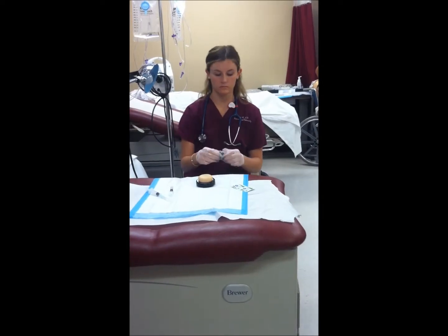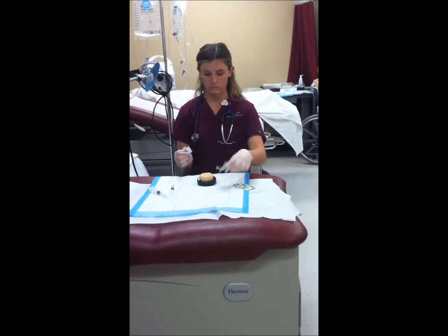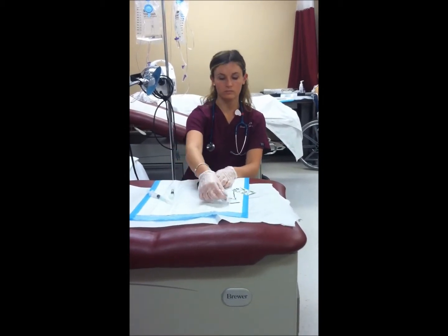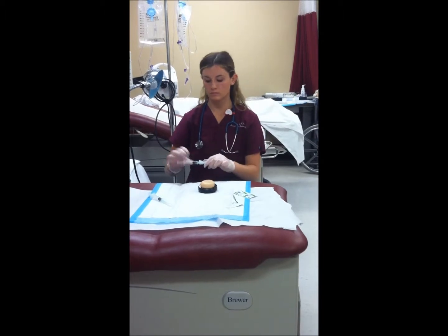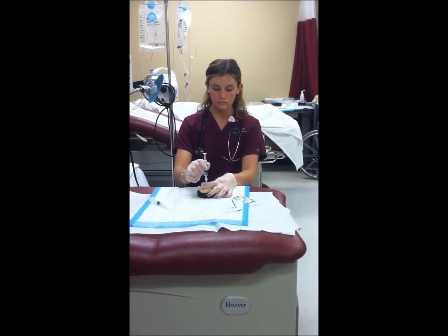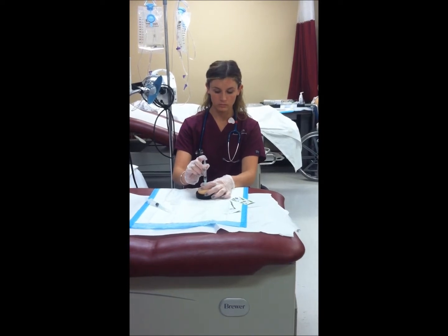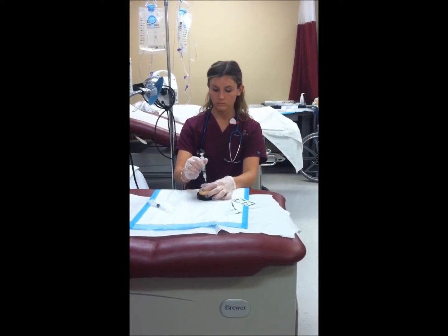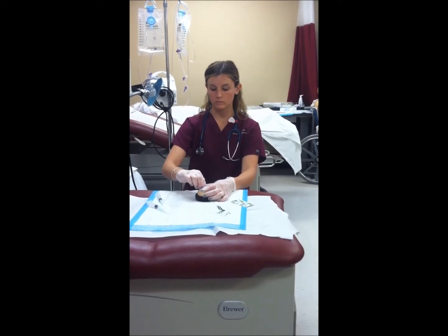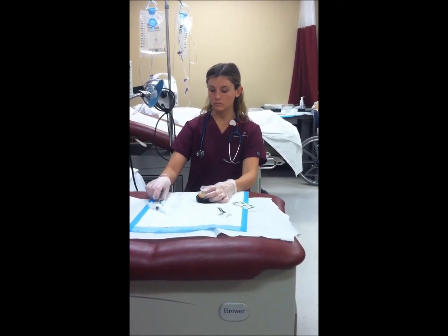When preparing for injection, first, cleanse the skin with an antiseptic wipe using a circular motion beginning with the center of the site and moving outward. Next, pull the skin taut and insert the needle using a dart-like motion. Have gauze ready to apply to the site after injection. Dispose of the needle and syringe in the sharps container and wash hands.